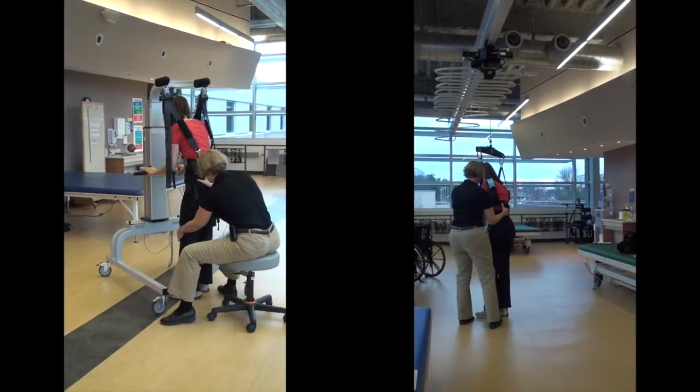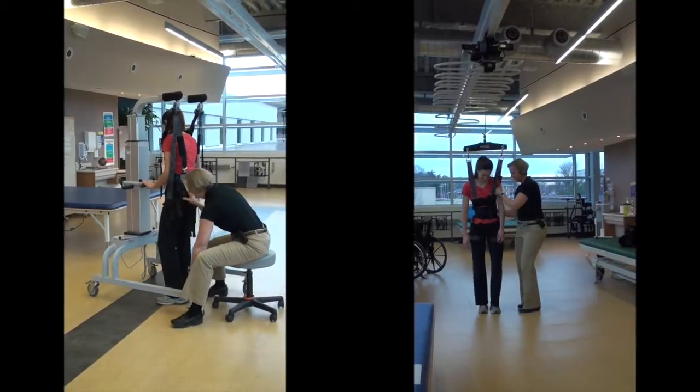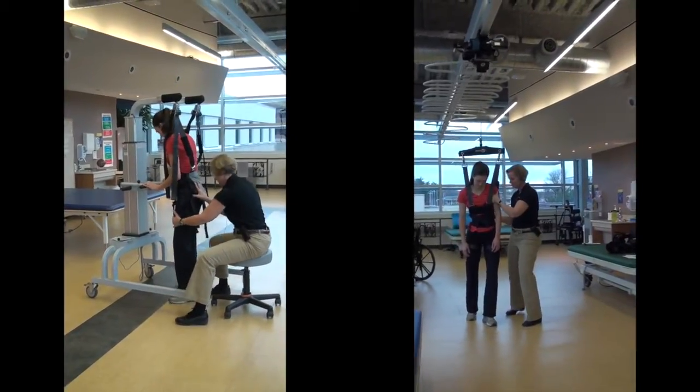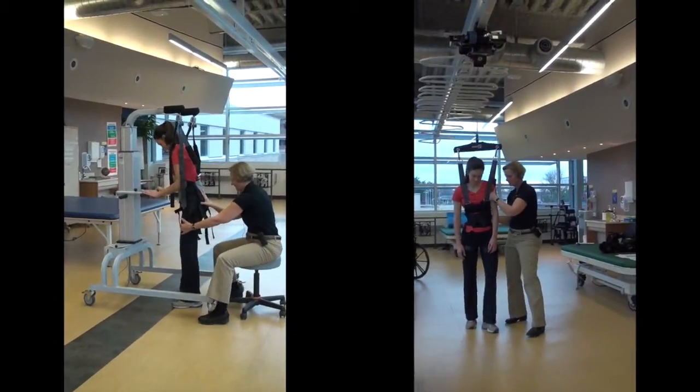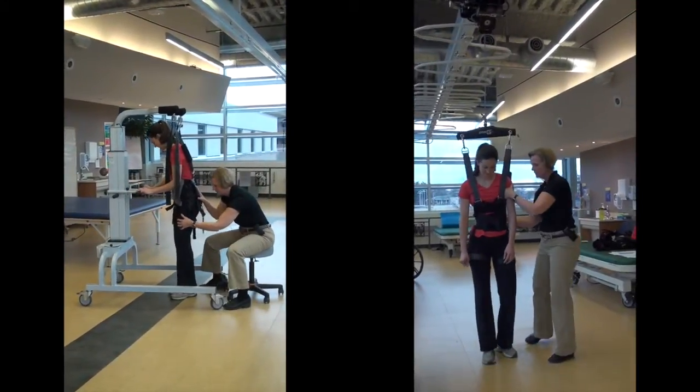Turning is an important aspect of therapy. Turns are possible in Zero-G with ease. A mobility frame can be quite difficult to turn on a natural radius and may be tiring for the patient and therapist to maneuver.